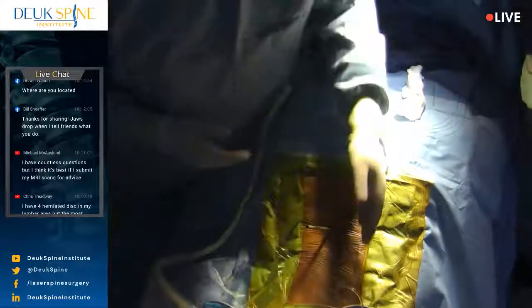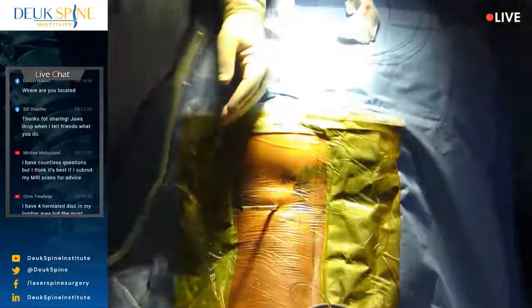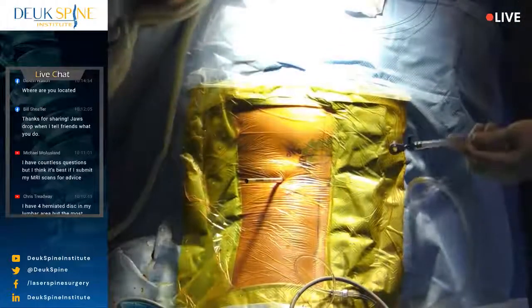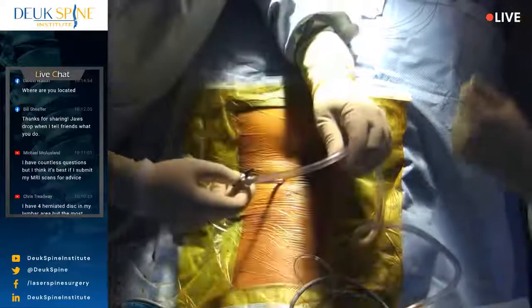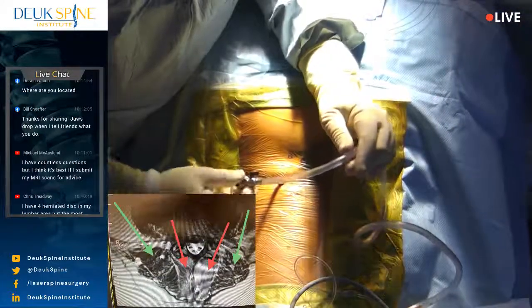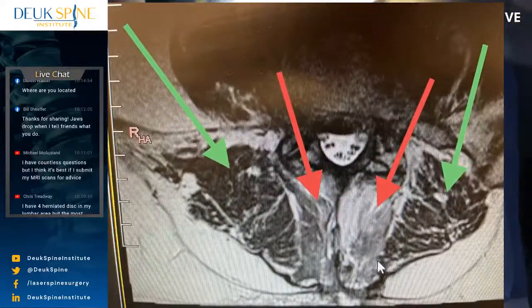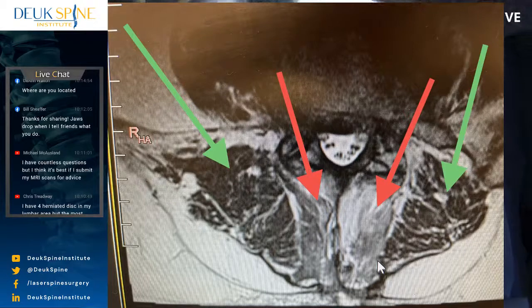So unlike open back surgery, microdiscectomy, laminectomy, fusion, artificial disc, where they're actually cutting the muscle and peeling it off your spine, there's massive damage going on there. Did you show our audience that picture? Yes, I have it up right now. All right, so take a look at the green arrows. The green arrows are the normal muscle. That's what normal muscle fibers look like on an MRI. And then look at the red arrows. Those are the muscles closer to the midline, and that's what was killed by that patient's laminectomy.